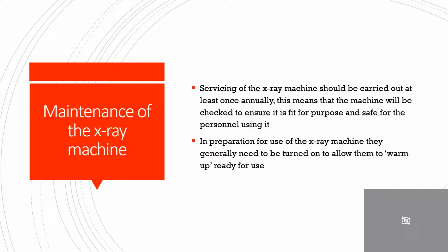Maintenance of the X-ray machine. Servicing of the X-ray machine should be carried out at least once annually, and this means that the machine will be checked to ensure it is fit for purpose and safe for the personnel using it. In preparation for use of the X-ray machine, they generally need to be turned on to allow them to warm up, ready for use.